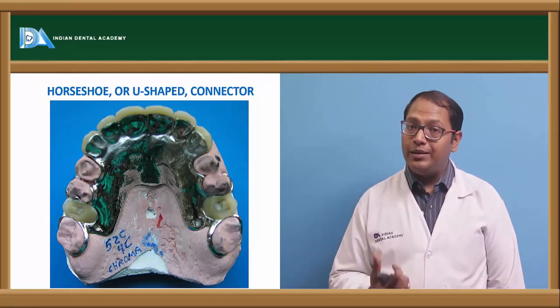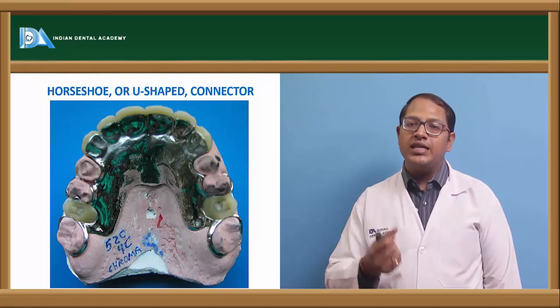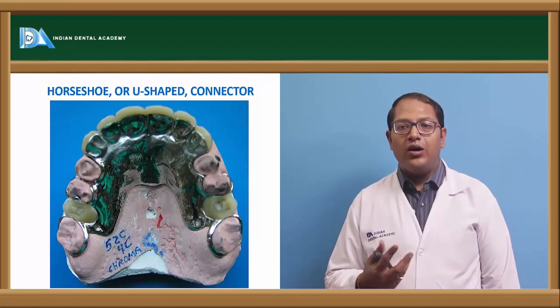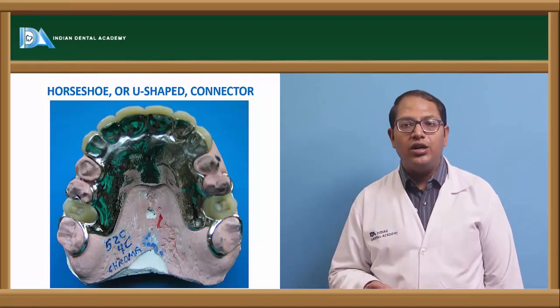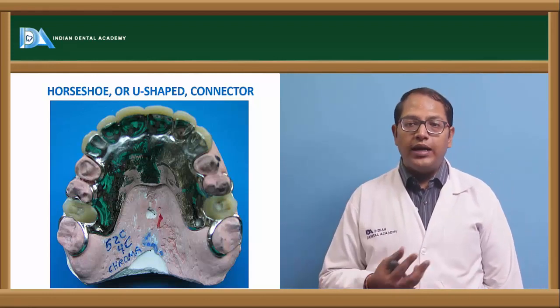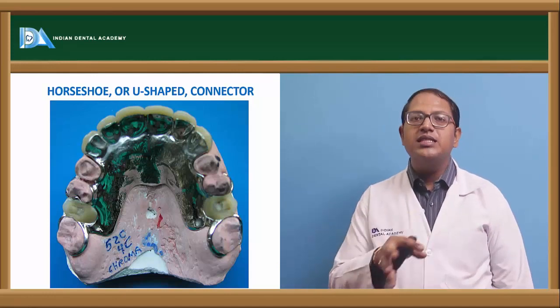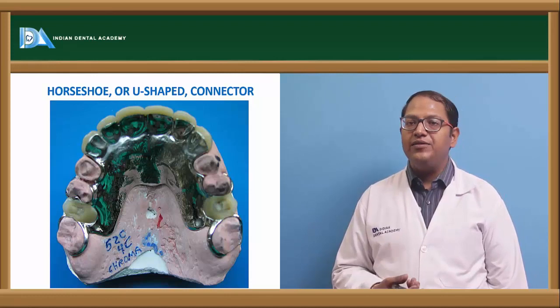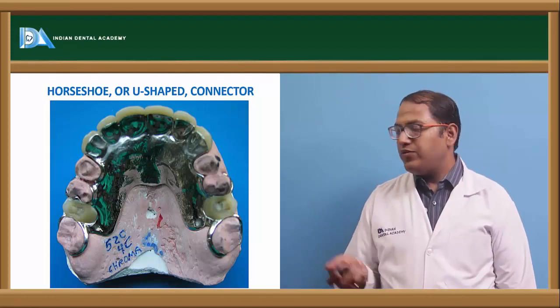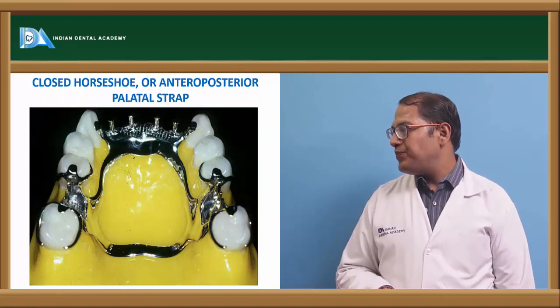Number one, and number two, the major connector will start losing its retention, of course, and also it has very little resistance to any kind of flexing movement that can occur at the open ends of this major connector, because it starts straightening itself. So what will happen? The flexing force will be developing. So when flex will happen, it will start losing its retention as normal.